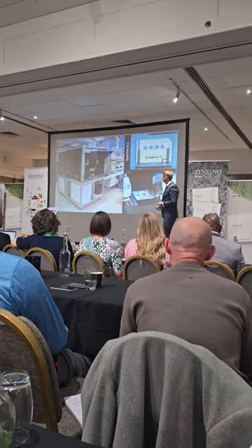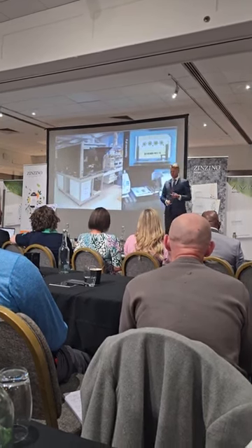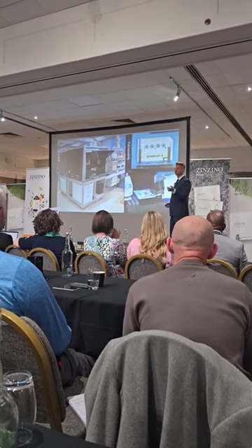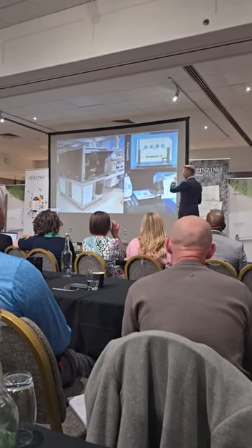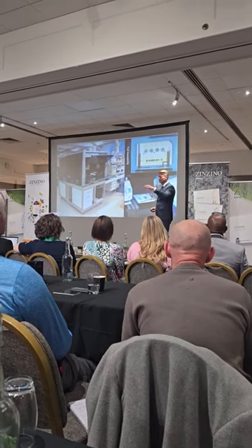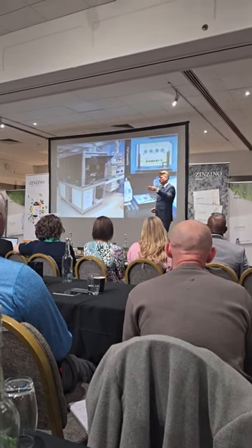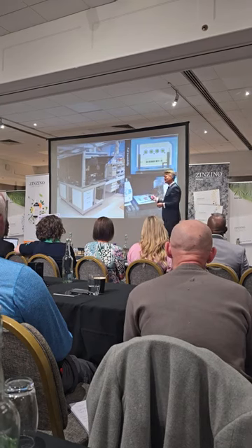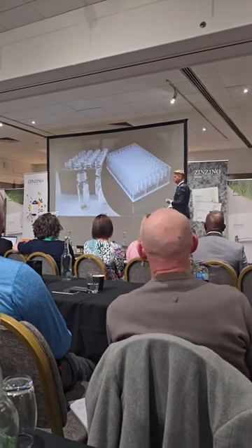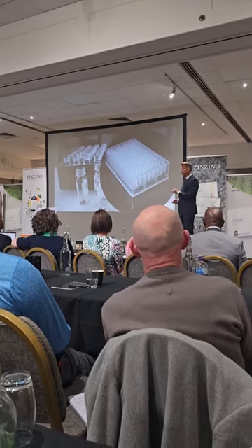Then we feed these samples into the machines, the robotic systems. We have a camera that scans the barcode into the database. It also will find the blood on the card, because sometimes you don't put the blood in the middle of the circle, but on the side, even on the card box, you know. So this camera system will locate the blood, will punch a few pieces of paper into these small glass vials with blood on.